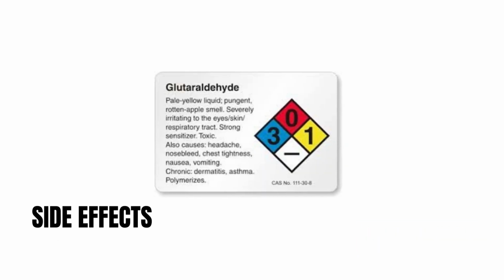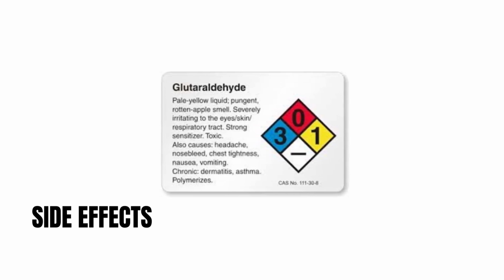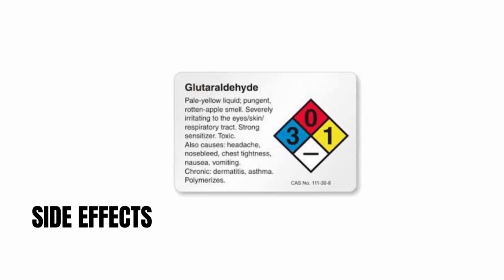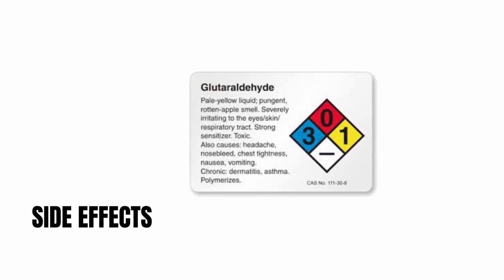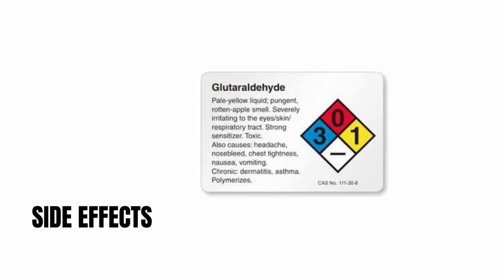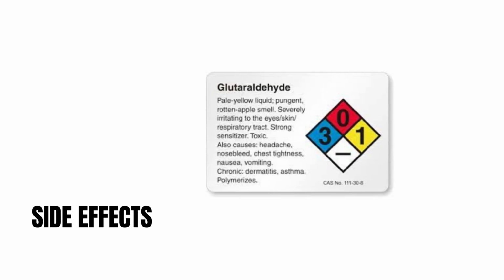Most of the adverse effects of glutaraldehyde are noticed in relation to the respiratory system or skin. Most of the adverse effects are due to inhalation of glutaraldehyde fumes while using it for disinfection purposes, or the glutaraldehyde solution coming in contact with the skin and causing allergic reactions.